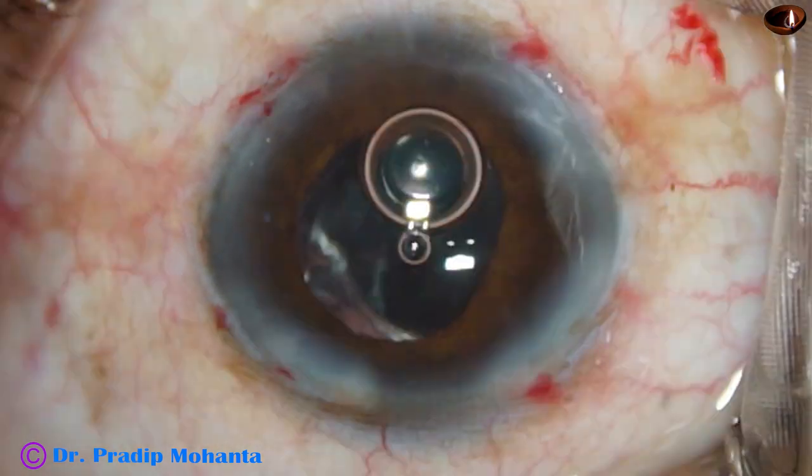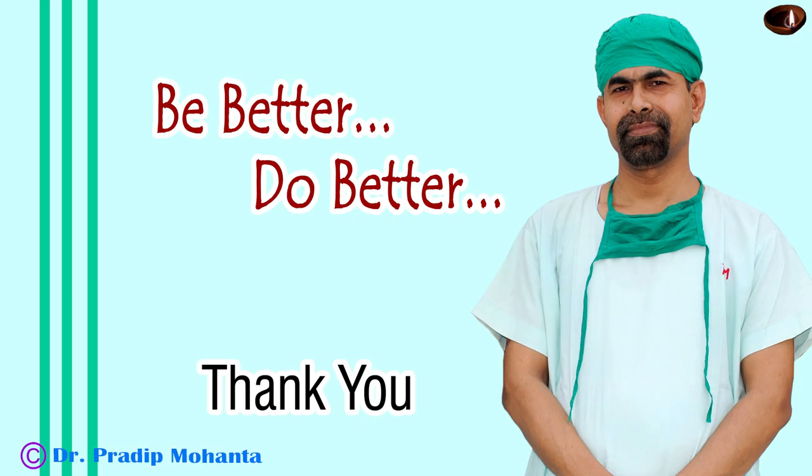Cortical cleanup is done very nicely, the side ports are closed by hydrating the corneal stroma, and the case is nicely done. Probably we should have used a capsular tension segment to center the bag properly, but it was beyond my patience. Thank you very much for your attention. I hope this video will help you in developing your surgical skills. Be a better surgeon than I am, and serve mankind with love, respect, and great surgical competence.